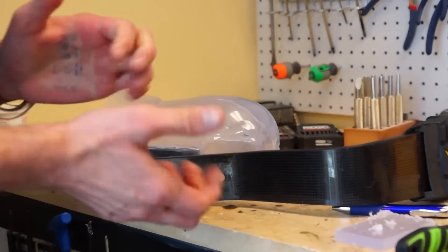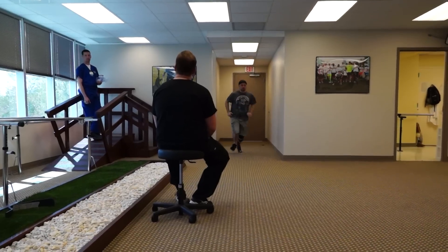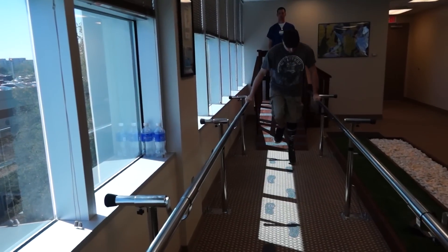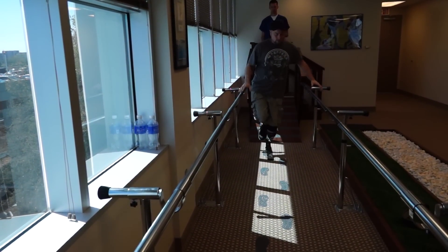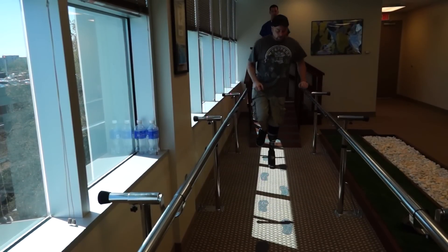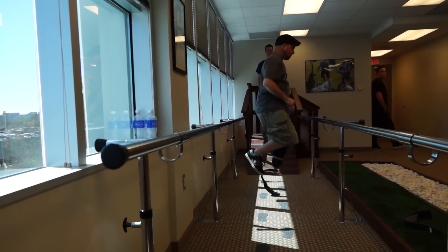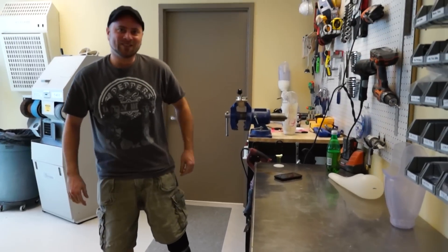Zach and Ryan will have to check out the way I run and make any minor adjustments if necessary. They do that with a combination of watching us run and some methods which may seem a little unconventional, like watching us hop up and down. Do you feel like it's shooting you up or kind of forward? Up. I feel like I'm on a pogo stick.